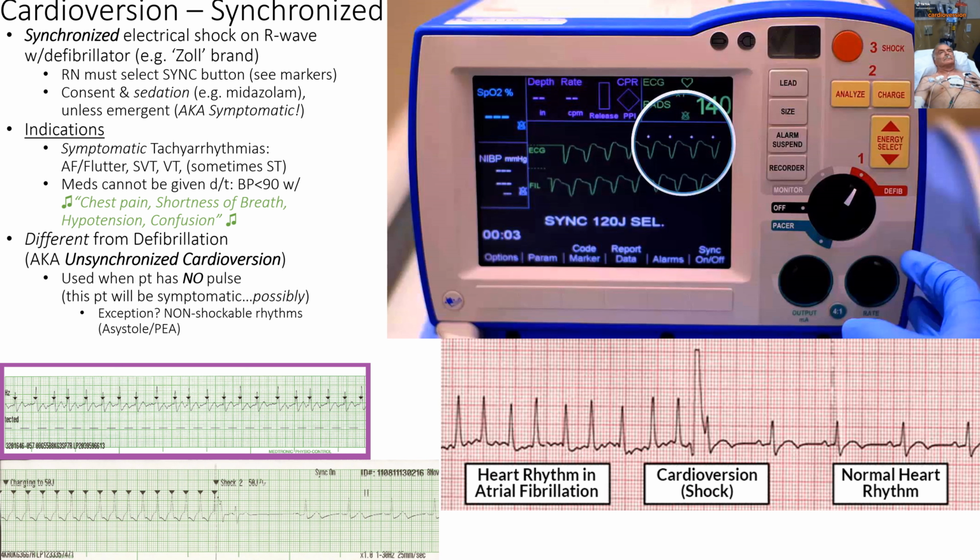Right? But if someone has a pulse, they're talking to you, it's like, okay, I'm going to give you some sedation because this is going to hurt, right? So I'm going to give you some sedation. You have to sign consent because this is going to hurt, right? And the risk is that we might shock you on the wrong thing because the nurse might not have hit the sync button, right? If they hit the sync button right here on this machine, the sync button is right there. This is called a Zoll, by the way, and it's a very popular device. There are other brands of defibrillators. But the Zoll defibrillator, or the defibrillator, is going to shock them out of that rhythm.